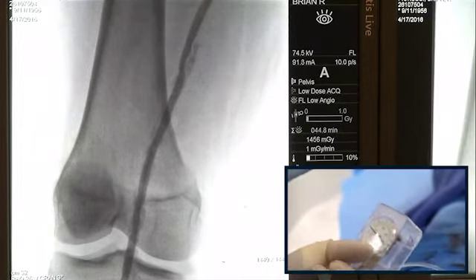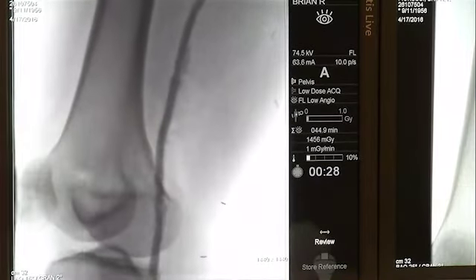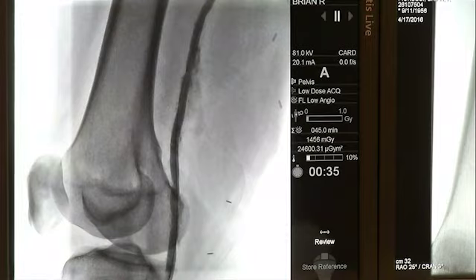Can you take an oblique view of that? Because sometimes if you take an oblique view, you realize it's just simply being displaced and it's fully expanded. And so sometimes, even when it doesn't look like it's fully expanded, with an oblique view, it appears to be that. I think that's not fully expanded, unfortunately.